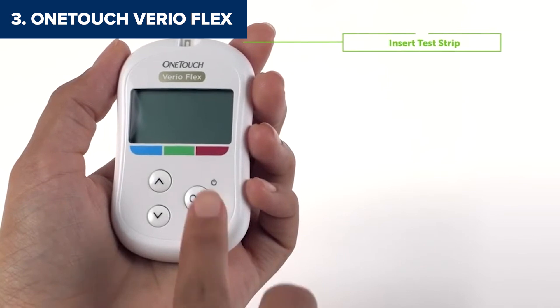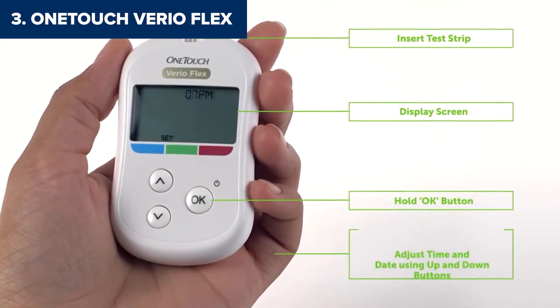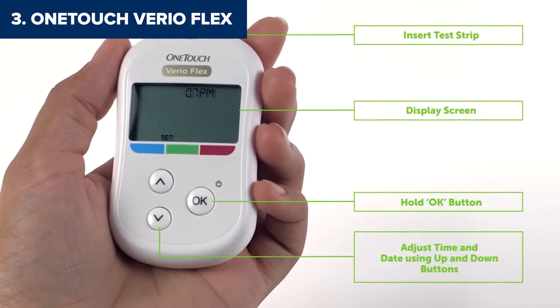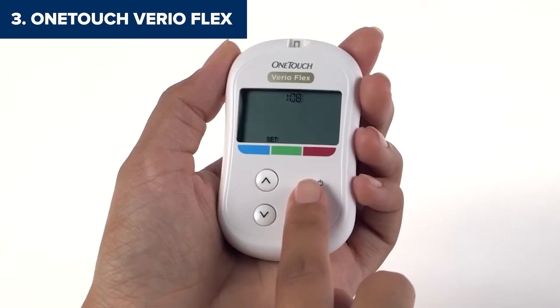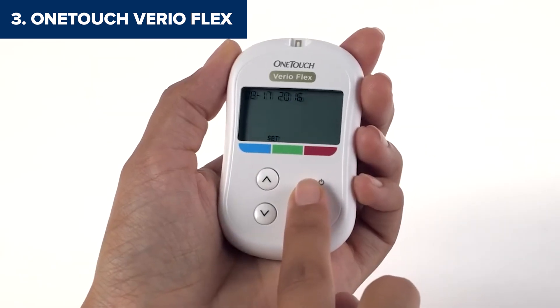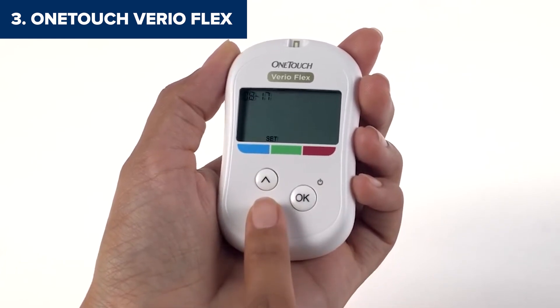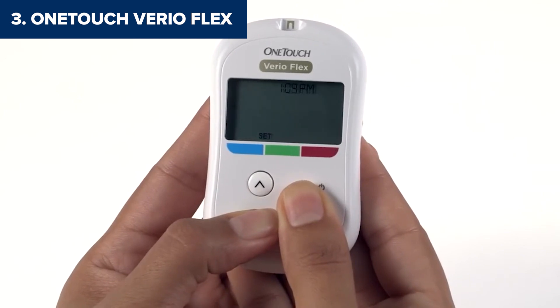This little detail can be a game-changer if you want quick feedback without diving into detailed graphs or charts. That said, it does have a couple of drawbacks. There's no backlight, so testing in low light can be a hassle. And while it stores 500 results, it doesn't calculate averages directly on the device, meaning you'll need to rely on the app to get a full picture of your trends. If you value portability and like seeing your data on your phone, the OneTouch VarioFlex is a fantastic, straightforward, and super easy-to-use choice.